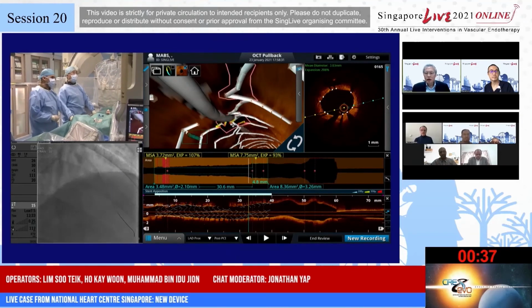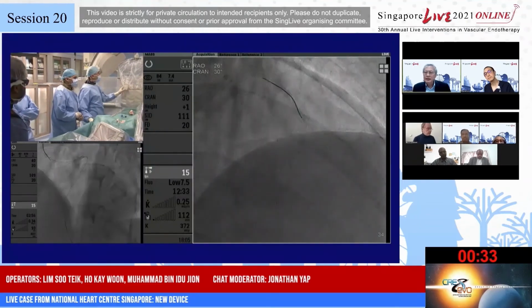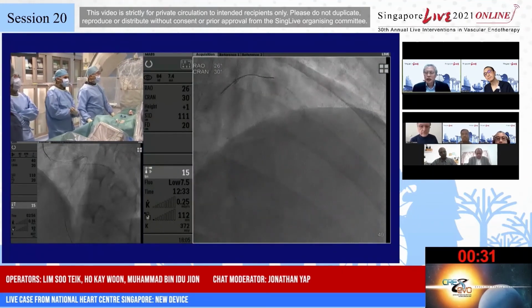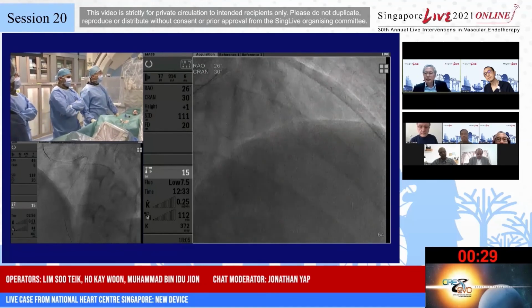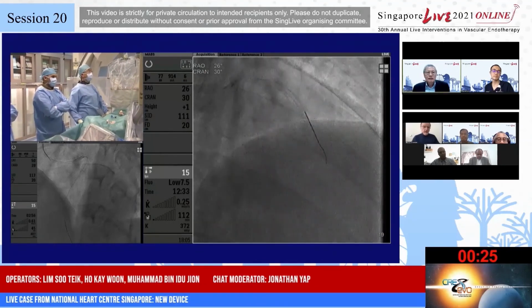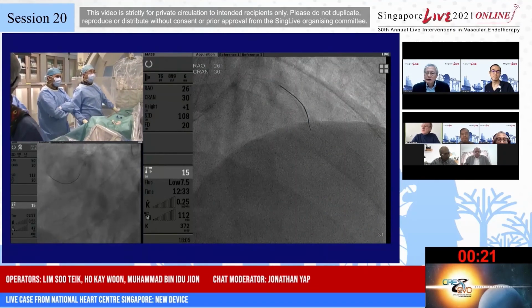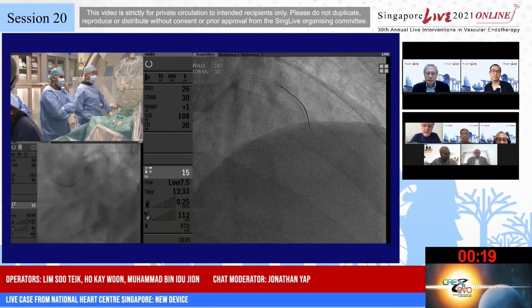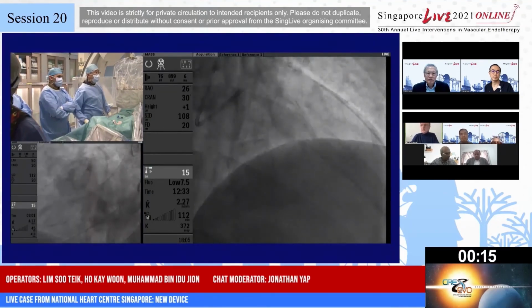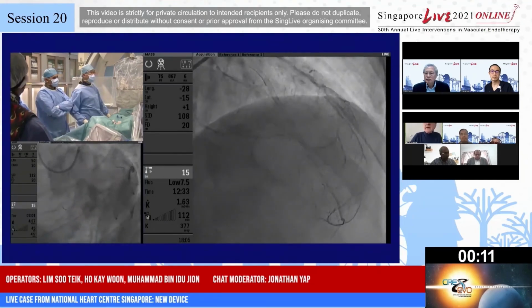I can ask Professor Colombo, there are some questions that the audience has asked. What is the recommendation for using DynamX in bifurcation and calcified lesions at this time? I think it's the same as a metallic stent. You need to prepare the lesion well. You need to post-dilate, exactly the same. You can do kissing balloon, you can do double stent.